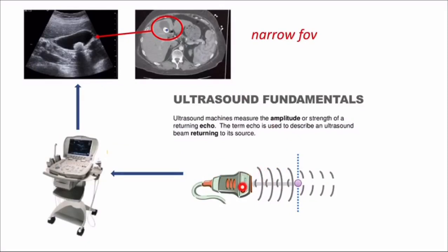Just to give you a glimpse on how the ultrasound image is produced, the ultrasound wave is produced by the piezoelectric crystals in the probe and is based on either reflected or transmitted sound waves. Based on the density of the organ being examined, if the organ or structure is dense like calcium, majority of the sound waves will be reflected, or if the organ or part of the structure being examined is less dense or fluid containing, majority of the sound waves will be transmitted.